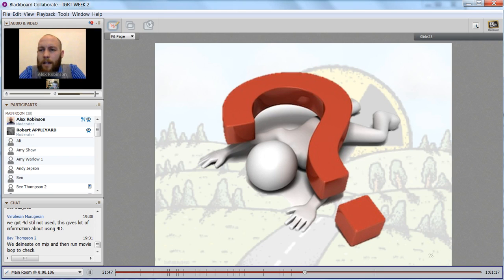I know that it is available on the Eclipse system because I've got experience with that, and it's not always perfect, and it does need a little bit of fine-tuning around it. However, it takes out so much time. With the GE scanner, with the Advantage Sim, another option that it does allow us to do is to play in this cine film, and I'm sure I can do that on the Eclipse system as well.